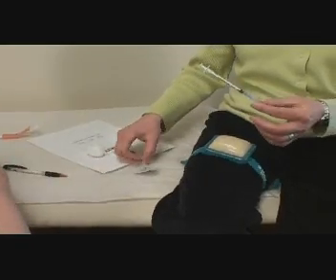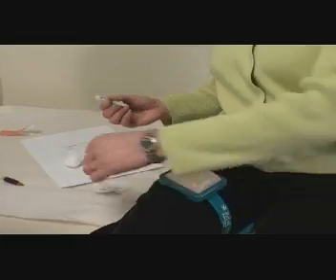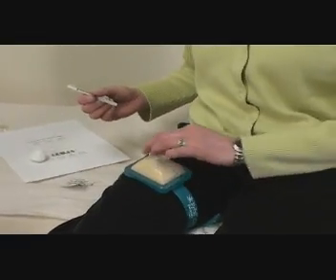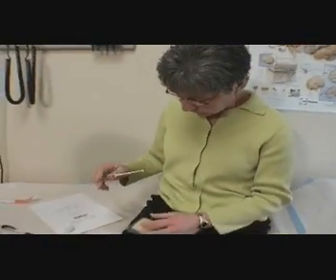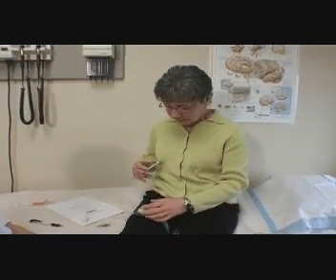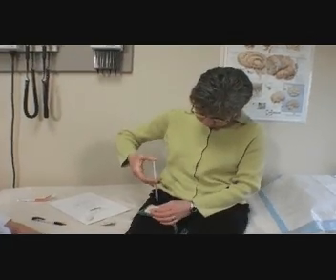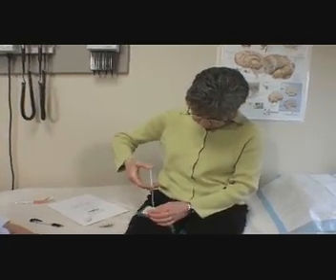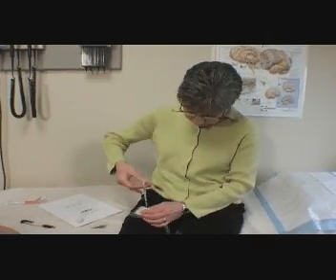If I have to. Okay. Clean off the site with your alcohol — there's actually some on there. And then wipe dry. However it's comfortable for you. You get to be a pretty good pro at it and try to go straight in. Inject. And straight out.